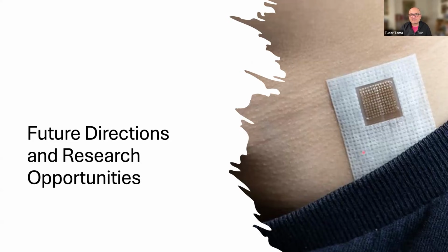So here people have put the membrane into a plaster that can be attached for a period of time on the body, and this behaves like a proper ultrasound machine and can be modulated like an ultrasound machine, which is again modulated like an abdominal probe, linear probe, or a cardiovascular probe. For the interventional pulmonology applications, I don't have something to tell you immediately. I can't see it immediately as being useful.